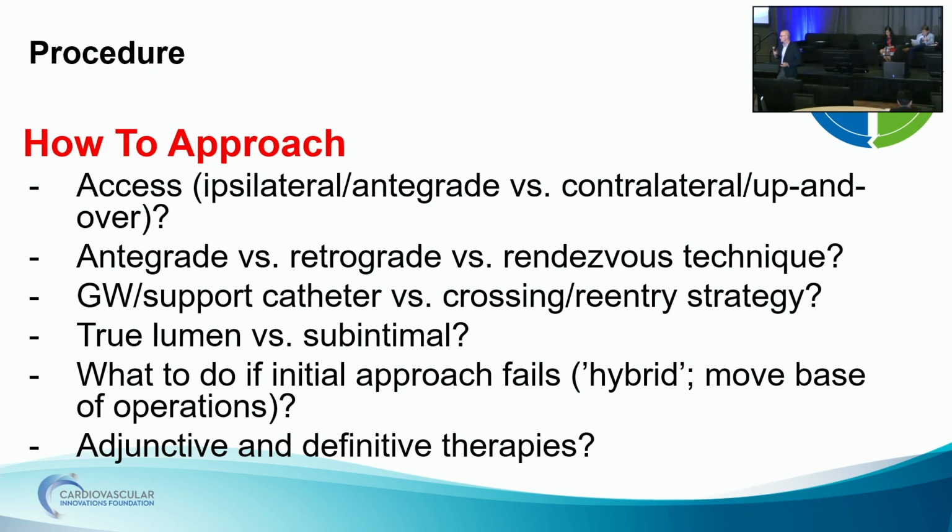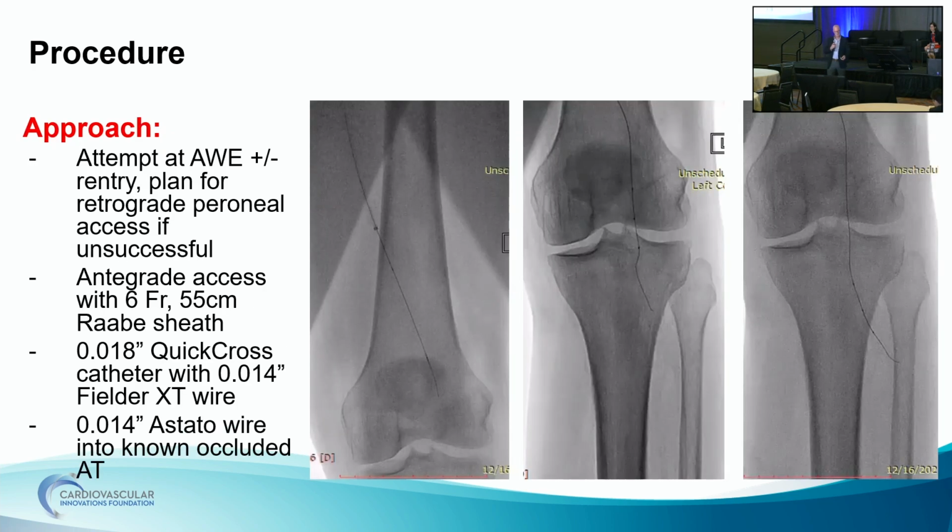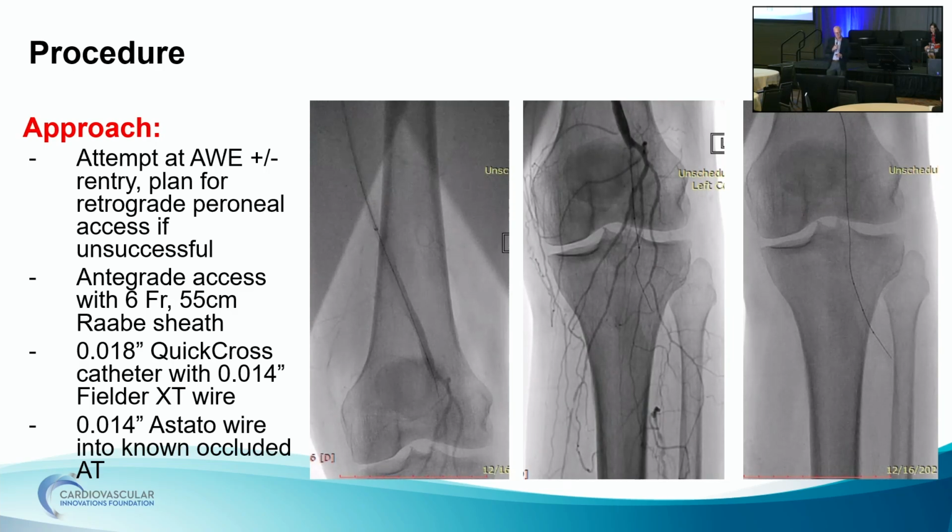Well, let's keep going unless anybody else has any suggestions or different thoughts. Okay. So the approach selected was antegrade with anticipated wire escalation, and then, if needed, reentry. And if that didn't work, then you talked about retrograde. The idea was that we'd come retrograde at that point.